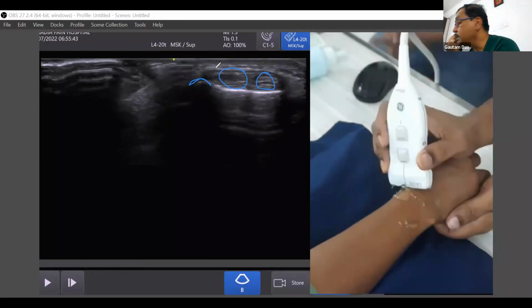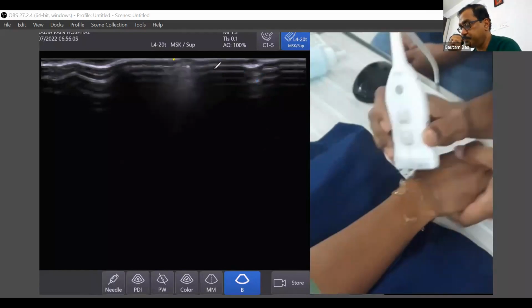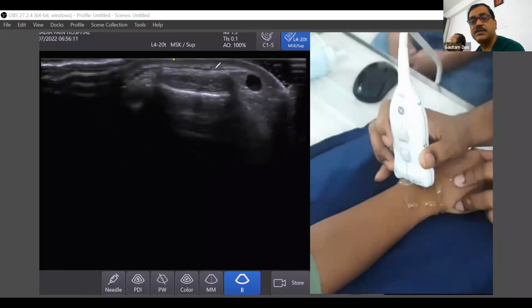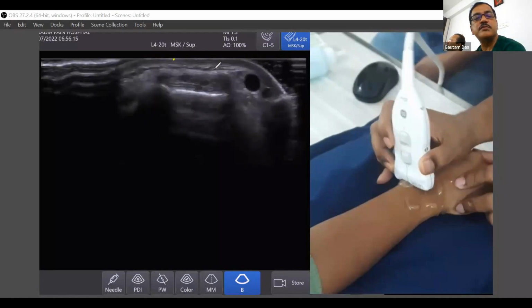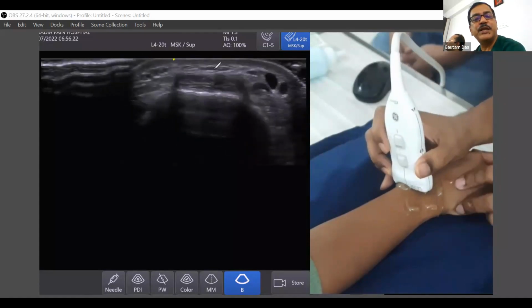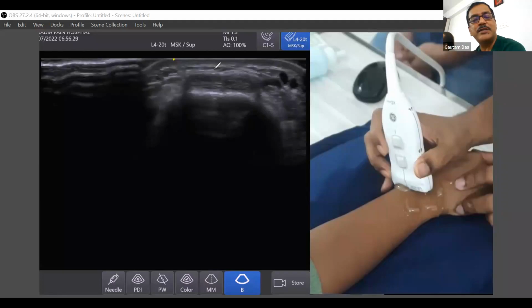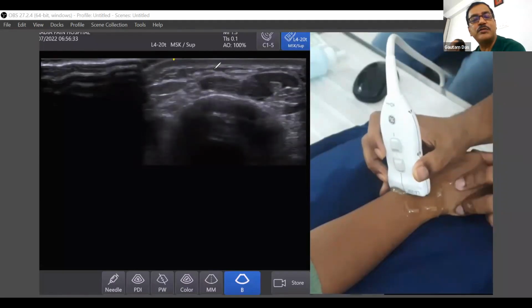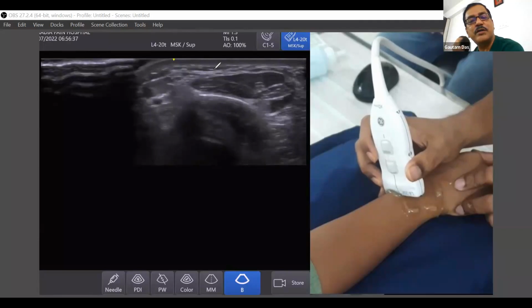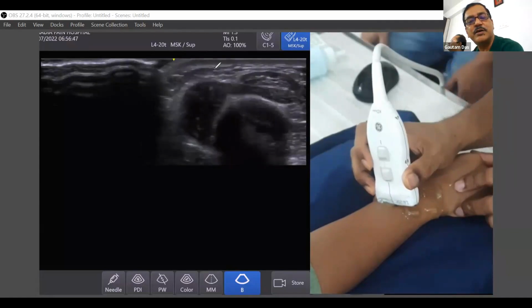Now if we are following these two tendons, see what is happening from the radial side, something is coming. We see some black and white mixture, tendons and myotendinous junctions coming. Now the black structures are coming over the second compartment muscles. Can you appreciate? Gradually, one and then another is slipping over the second compartment. So this is the area of the proximal intersection.